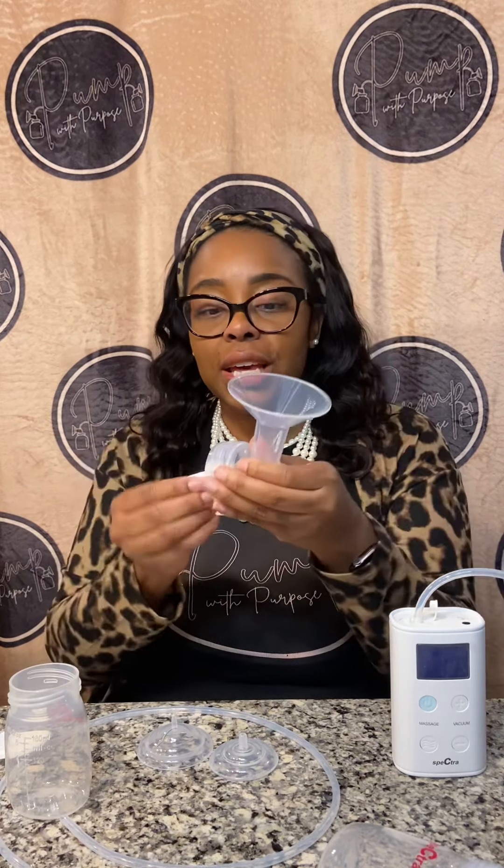I'm going to talk with you about what comes in the box and how to assemble it. I have one bottle already assembled here, and then the flange — it's one piece. I put on the duckbills, put on the bottle, and then the backflow protectors. I put the smaller side on around the right piece, then the bigger piece, then the tubing.